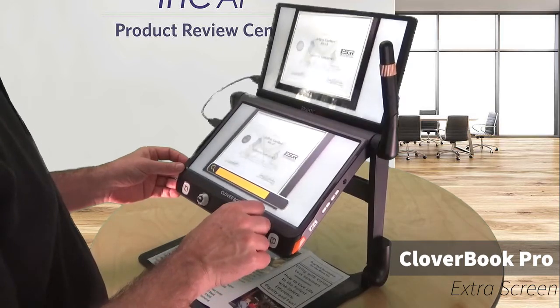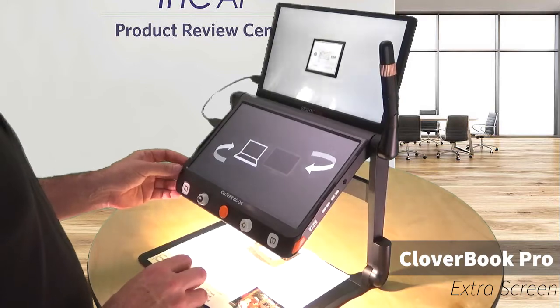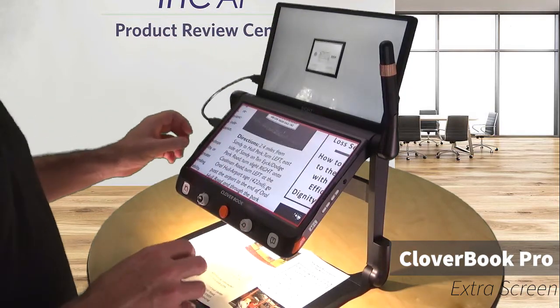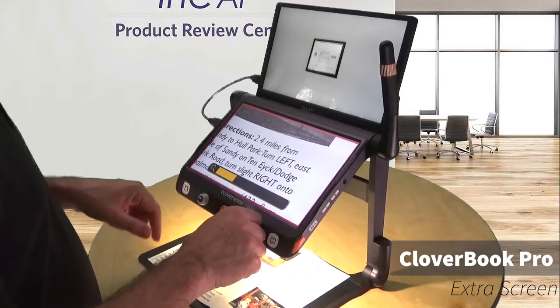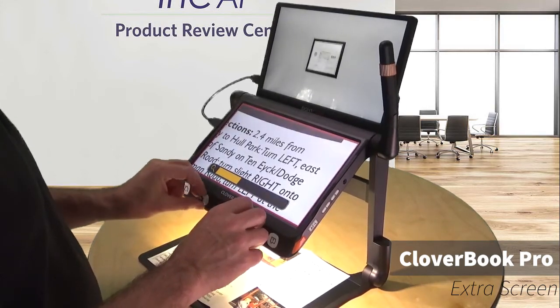Maybe I can get in close enough that you can see it. And if I hit it again, I'm actually going to get each image on a different screen. So now I have my distance cam, I have my close cam, and the one that's closest to me, I can control everything still here, change the contrast, do everything I want to do.